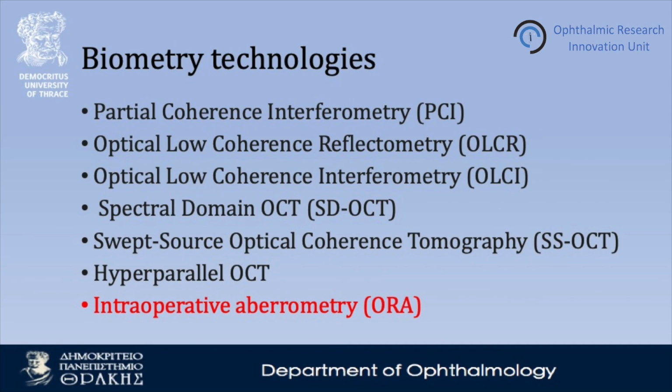Modern biometry technologies are used in pseudophakic presbyopic correction. Among them are partial coherence interferometry, optical low coherence reflectometry, optical low coherence interferometry, spectral domain OCT, swept source optical coherence tomography, and hyperparallel OCT. All the aforementioned biometry technologies are included in the preoperative procedures of presbyopic corrections.